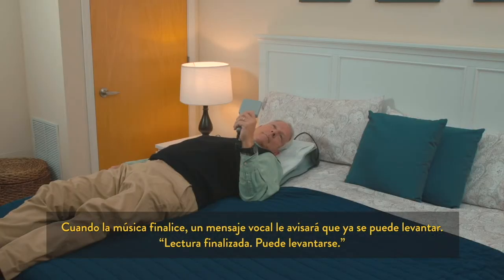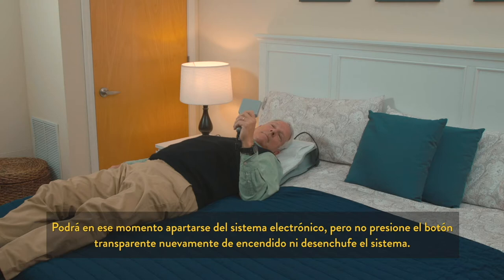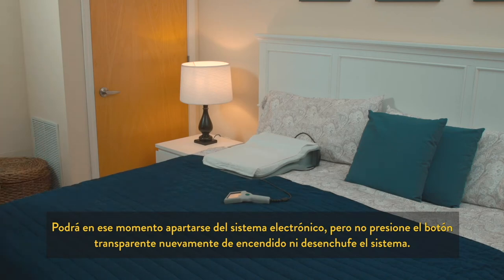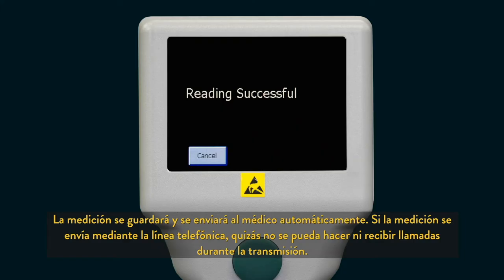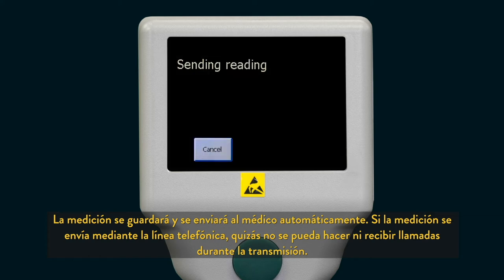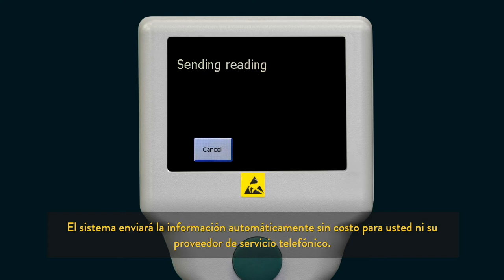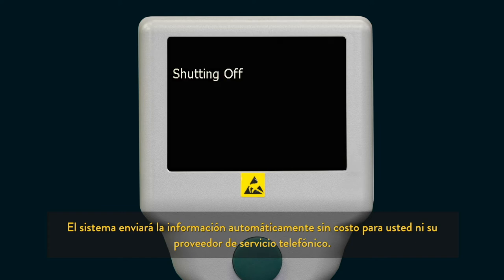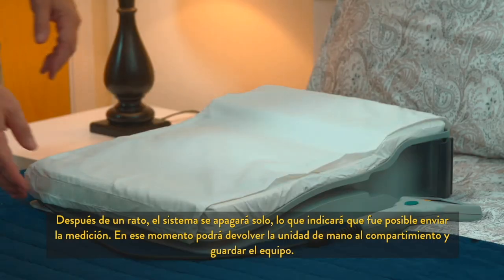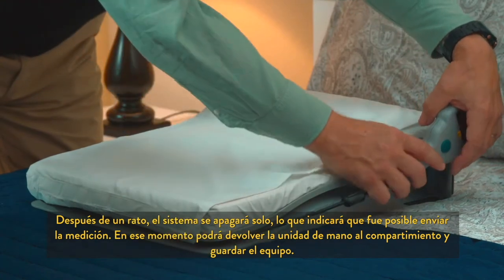When the music finishes, the voice message will let you know that you can get up. At this point, you may step away from the electronic system, but do not push the power button or unplug your system. The reading is automatically stored and is sent to your doctor. If the reading is being sent through your telephone line, you may not be able to make or receive a call during the transmission process. The system automatically sends the information at no charge to you or your telephone service. After a few moments, the system will turn itself off, indicating that the reading was sent successfully. You may then return the handheld unit to the cradle and store your unit.